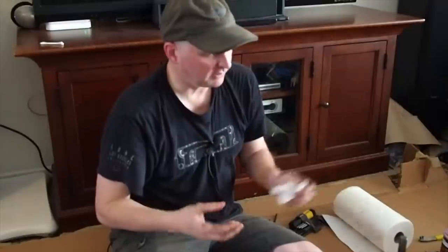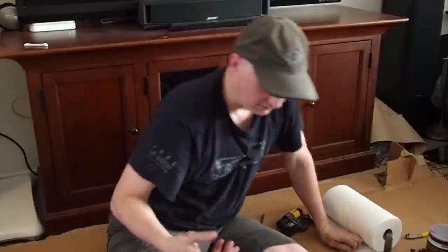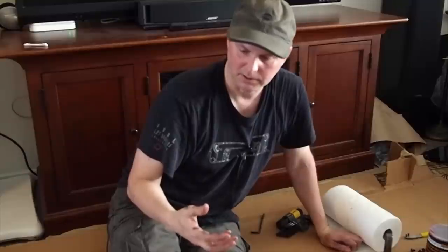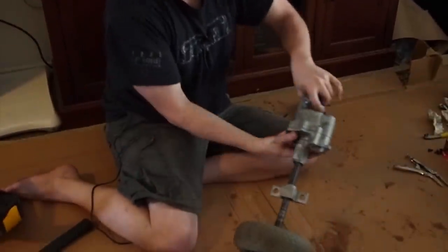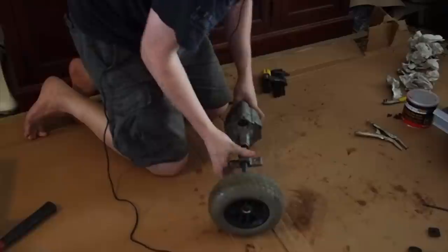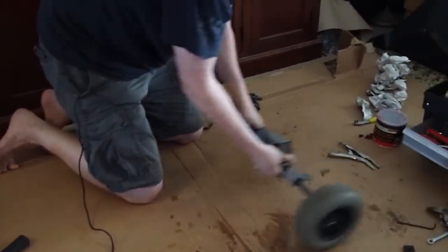So my theory was that I put the whole thing together too tightly and it needs a little more wiggle room, which makes sense to me because you don't want the gearbox to be too tight anyway, because there needs to be some room for the grease to coat the parts. I've taken this apart and put it together about twice now. Right now, only two bolts are holding it together. That's all I was trying to do. And what I'm doing is I'm holding one side, and it's not making a whole lot of noise when I hold one side and move around. If I do both wheels like they were going together, it's pretty quiet. I can hear a little bit of a zoom in one direction, and that's probably the reverse direction.